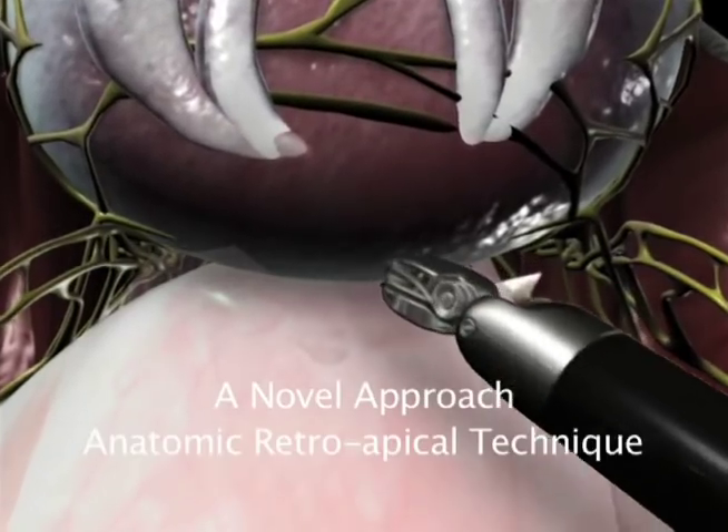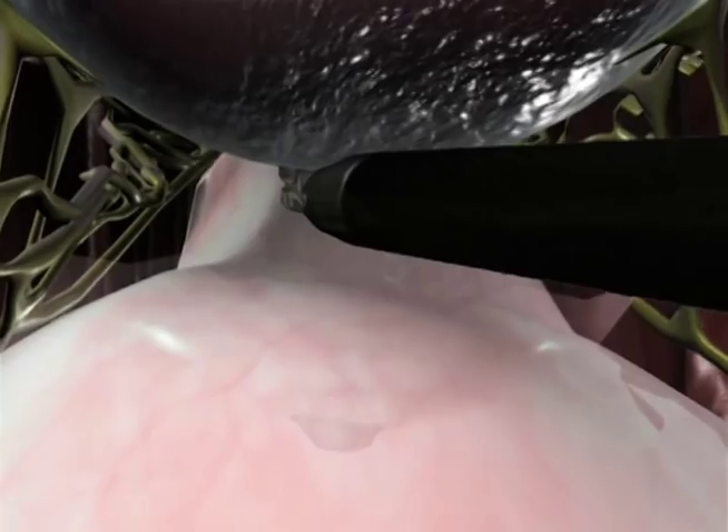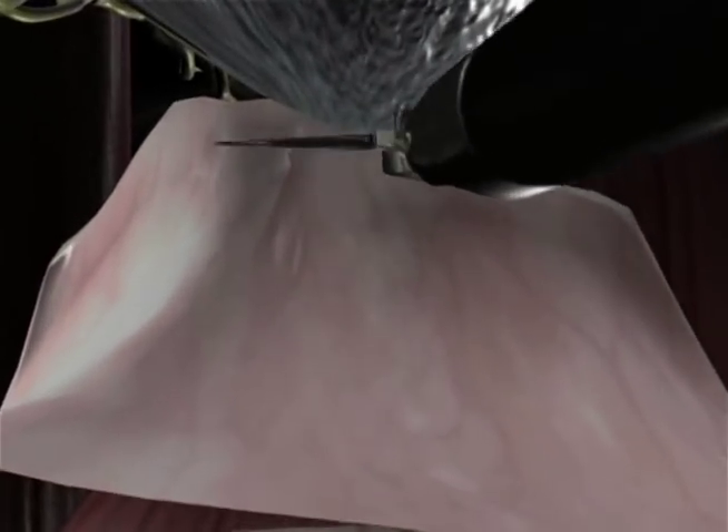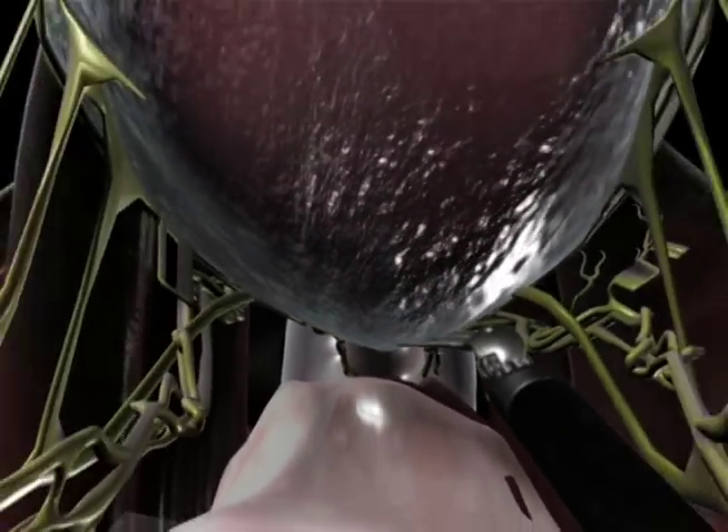A novel approach: the anatomic retroapical technique. We approach the prostate-urethra junction from the posterior aspect of the urethra. Posteriorly, the urethra is only covered by Denonvilliers' fascia and the rectourethralis muscle. This is a clear path to the apex.